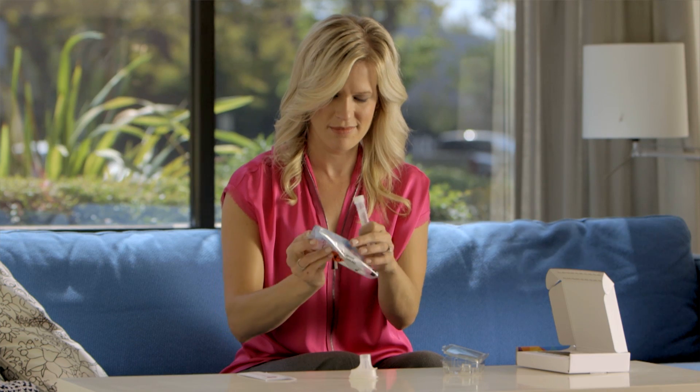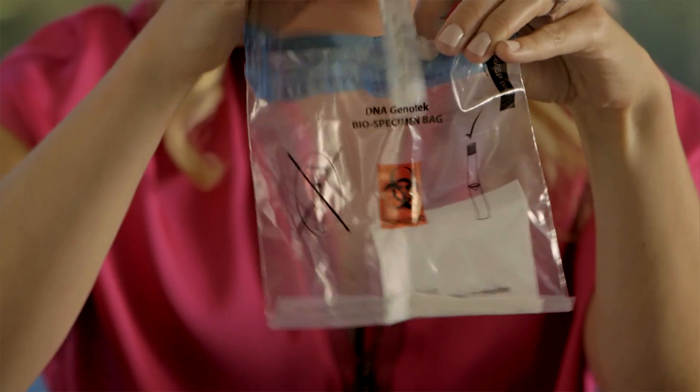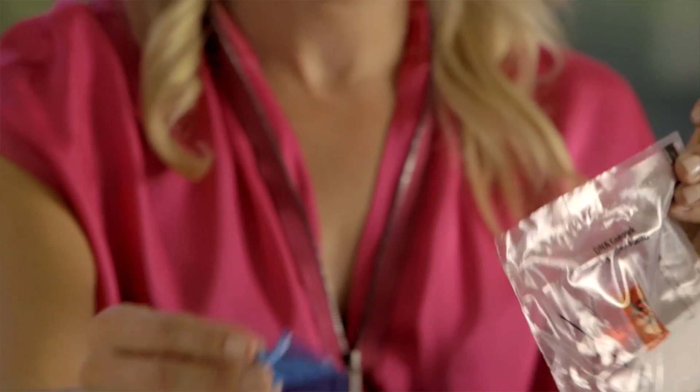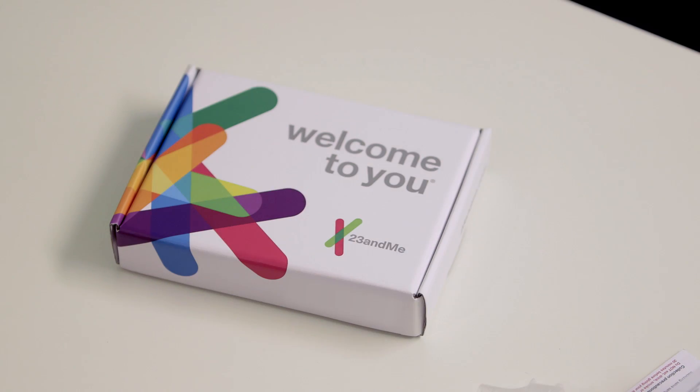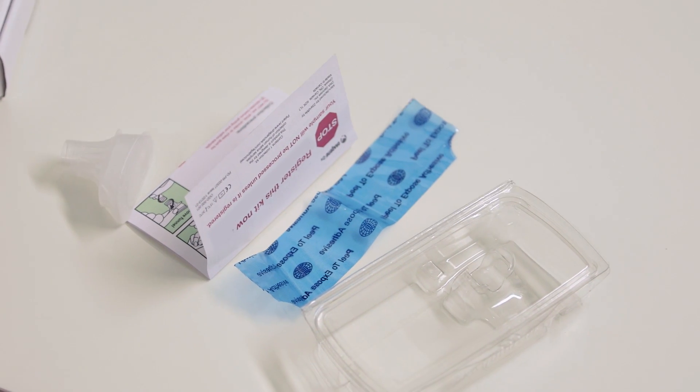Now your DNA is ready for transport. Open up the biohazard bag and place the tube inside. Remove the adhesive backing and seal the bag shut. Place the bag directly inside the box. The plastic clamshell, instructions, and funnel cap can all be discarded.